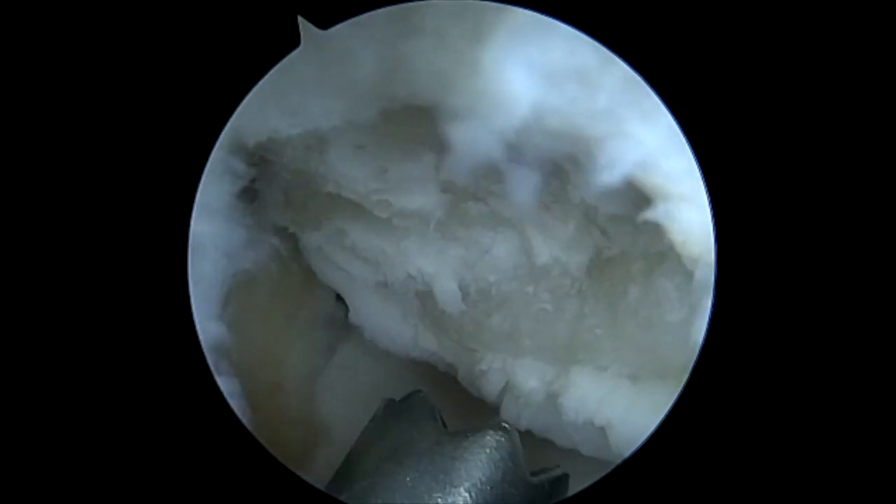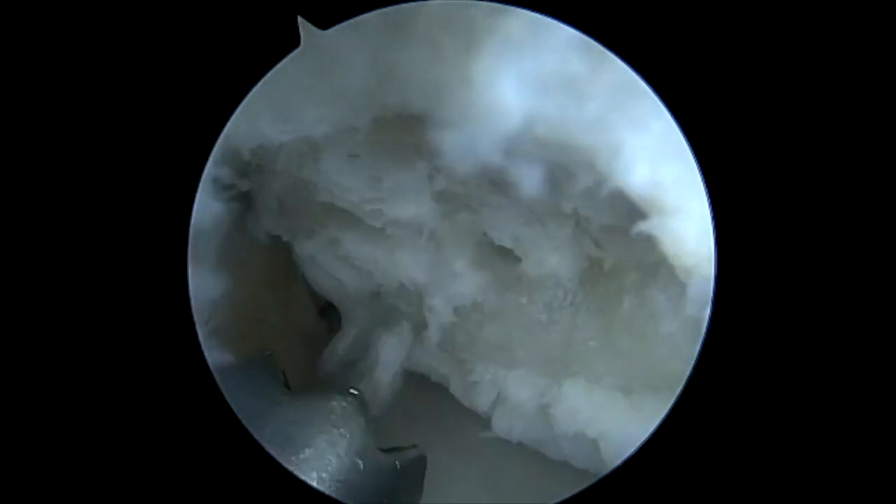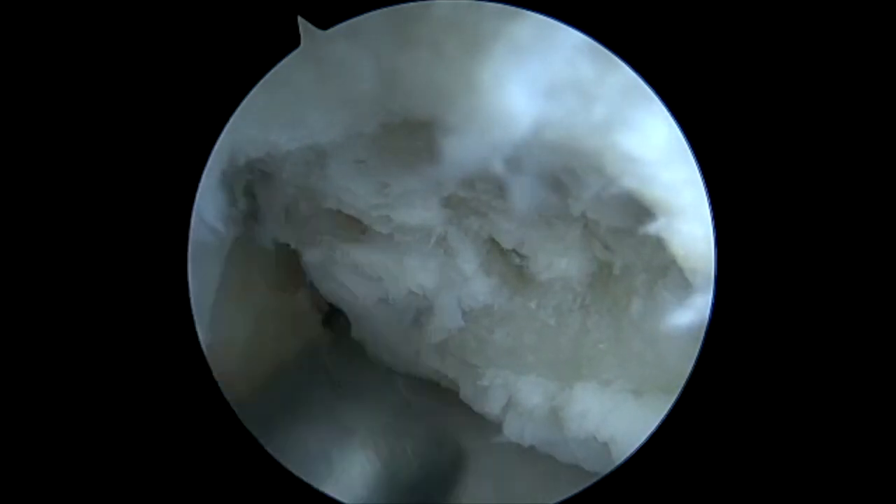We use a small K wire to perforate the subchondral bone and stimulate the marrow elements — also known as microfracture of the base.